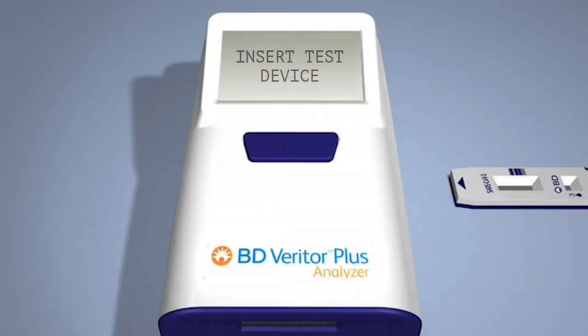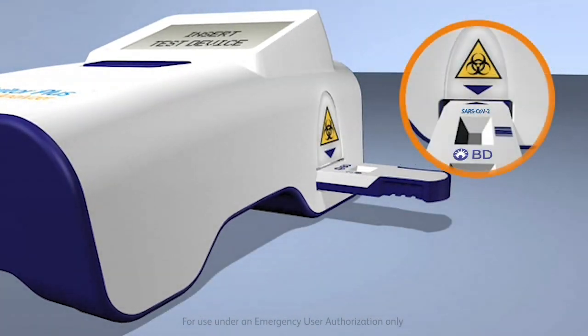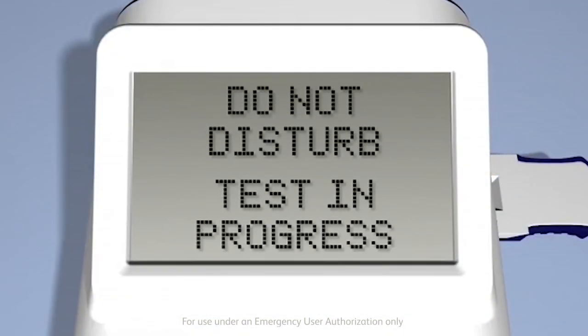After adding the specimen, be sure to keep the test device and analyzer horizontal to avoid spilling the specimen, and insert the device into the slot on the right-hand side of the analyzer. The system's unique keyed feature ensures that the device can only be inserted the correct way. Once the device is inserted, the display window will show "do not disturb test" and progress.